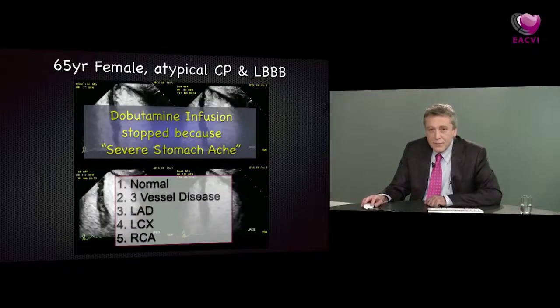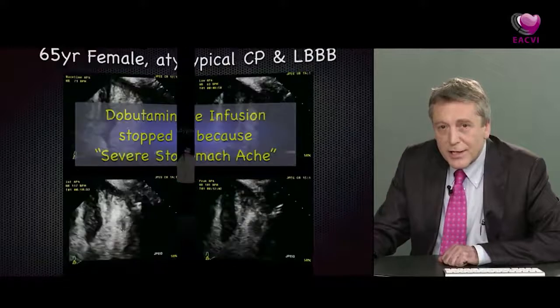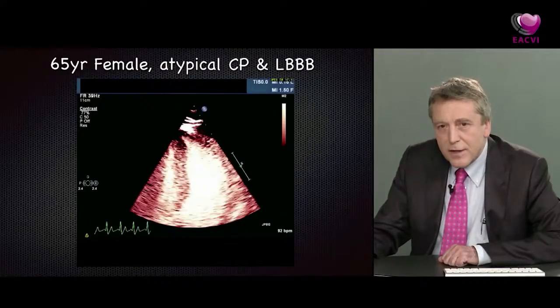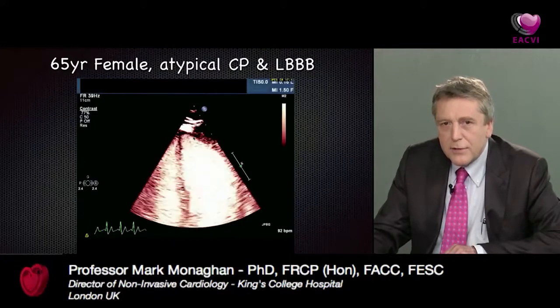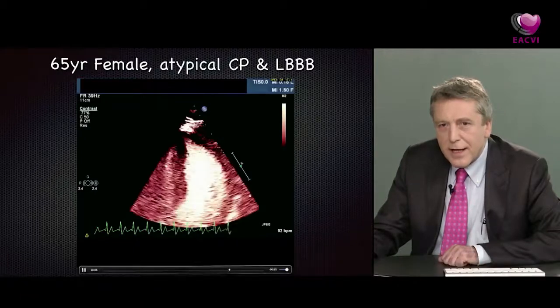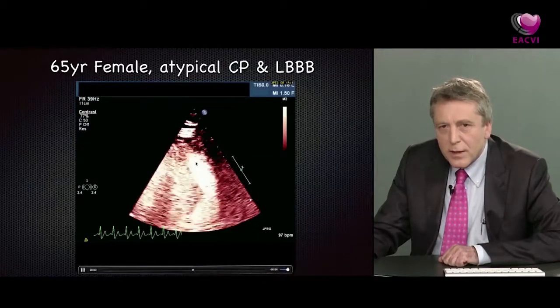So let me just move on and show you the myocardial contrast images in this particular patient. Even before we do the flash, you saw right at the beginning of the sequence there was contrast in here, but you can see that after the flash, it really takes a long time for the apex to reperfuse, and that extends into the lateral wall and probably the apical septum. Here is the 2-chamber view, and again, watch what happens after the flash, and there's the flash, and really quite a persistent defect here at the apex, possibly going a bit into the anterior wall.